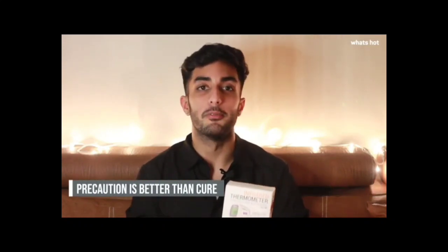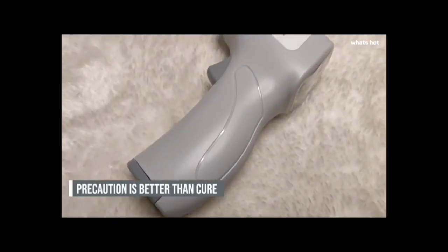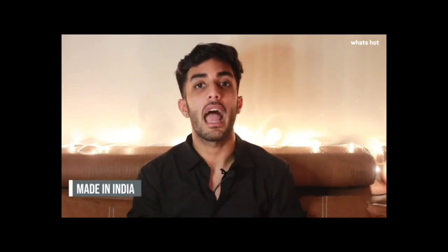It's always said that precaution is better than cure. The Vandley Thermometer in today's time is the most essential thing anyone or any household can have. This product is made in India and it comes with a 3-year sensor warranty.